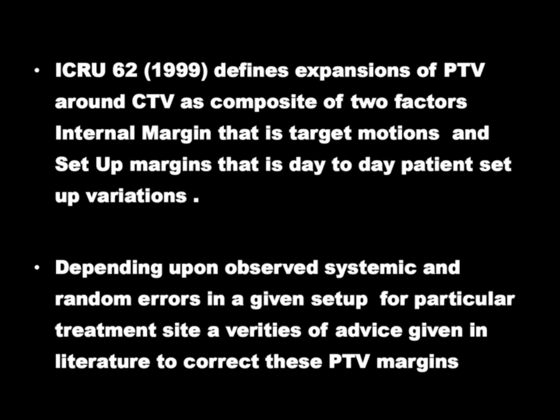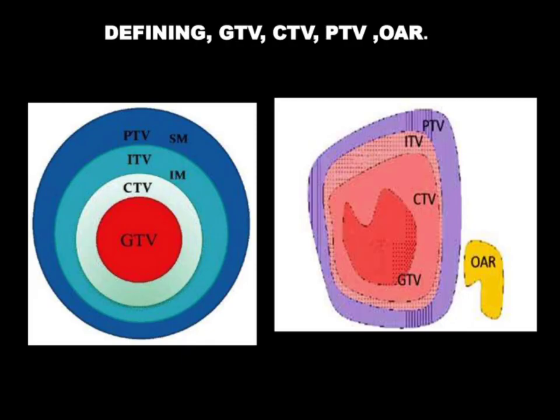If, as an assumption, dose calculation is done on the CT image data set on the treatment planning system, and dose delivered throughout the entire course of radiotherapy is assumed the same, that is basically a gross error, because of internal organ motion like target volume with respiration, peristaltic movement, and cardiac pulsation, patient weight loss during the radiotherapy, the change in the treatment volume, and bladder and rectal filling leading to movement of the prostate tumor.